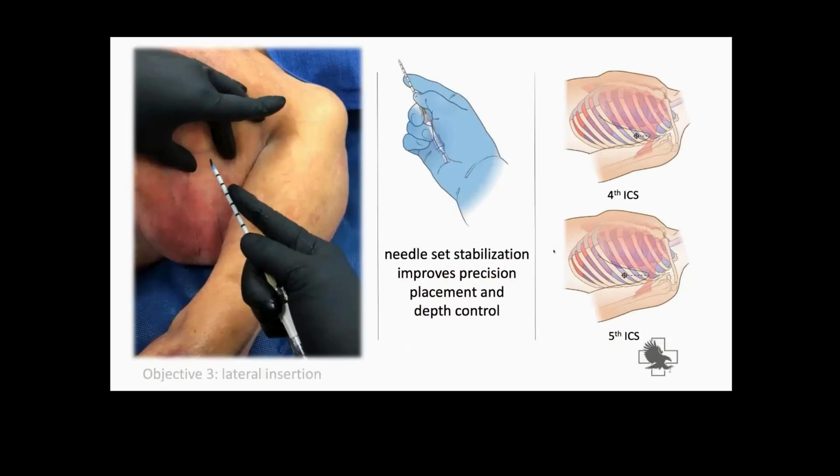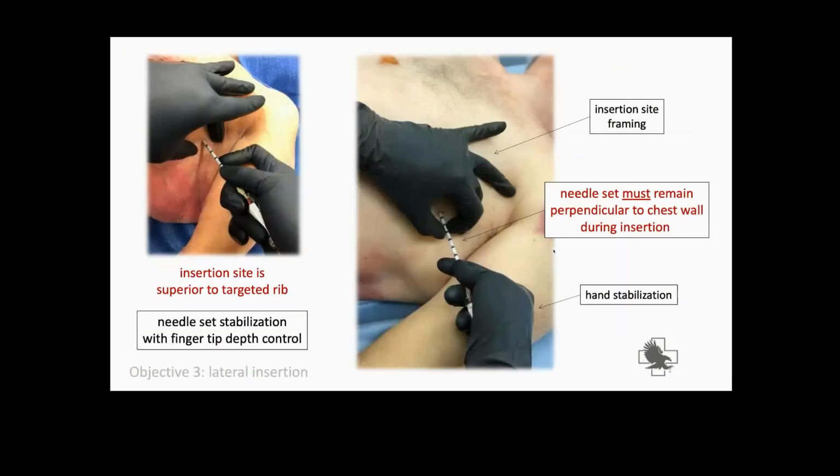You're going to go in with a stable needle. Once again, they're showing a little different technique here than what we identified, versus holding with the one-way valve tip. Here they're showing the pencil holding technique where you're trying to control the needle tip as it's going in, and once again, ensuring that you're not going to accidentally insert the device at too great a depth. So you want to insert this, identifying what it means to be perpendicular to the chest wall at this location. Might not necessarily mean that you're quote unquote parallel with the ground or parallel with the stretcher.